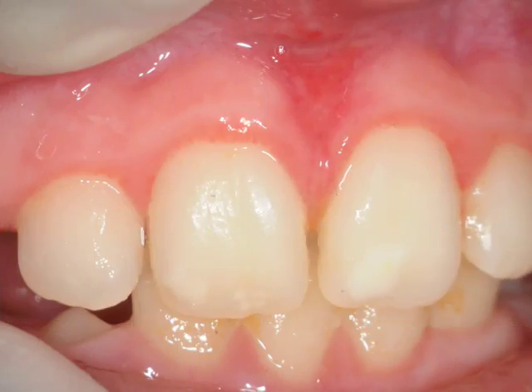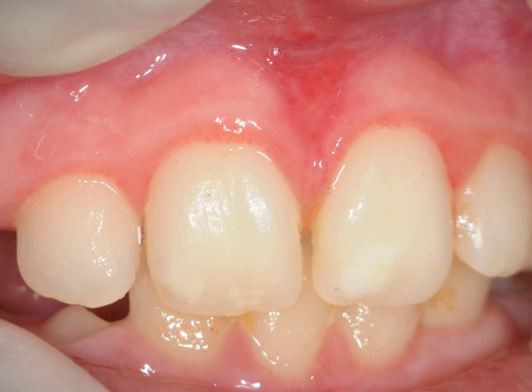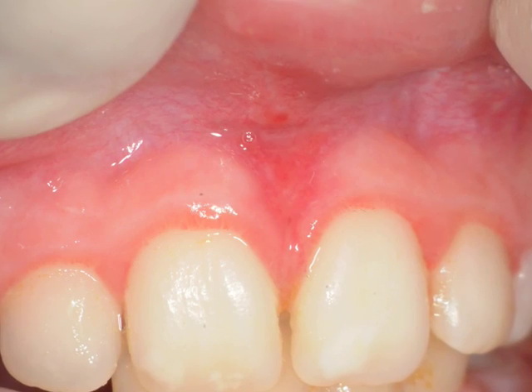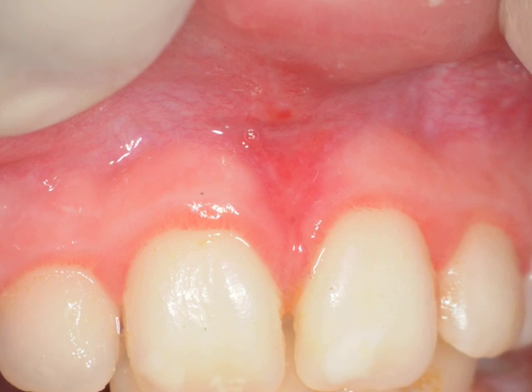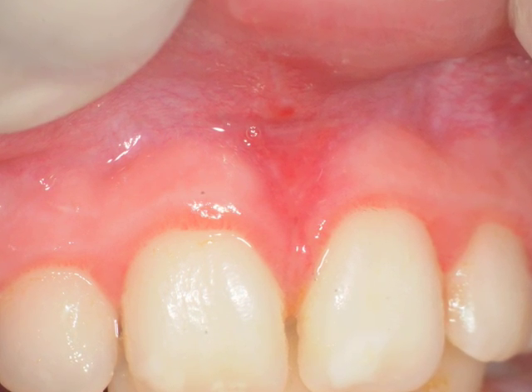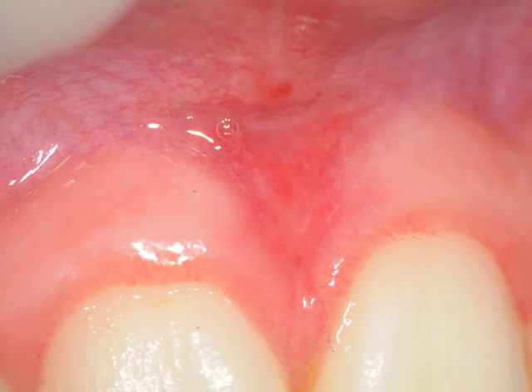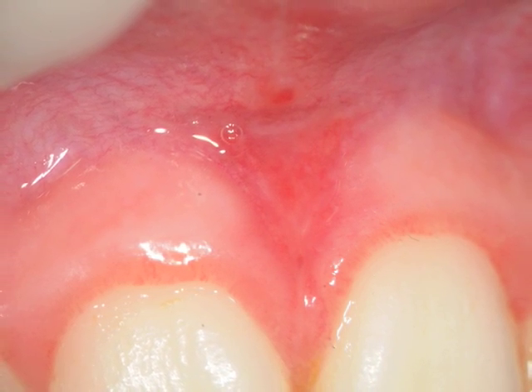At this point we have the patient return about 8 days later. At various magnifications you can see the healing that has occurred from the frenectomy done just a little over a week before. The tissue is now healing — it's pink and healthy, and it's really been a nice job of changing the frenum.